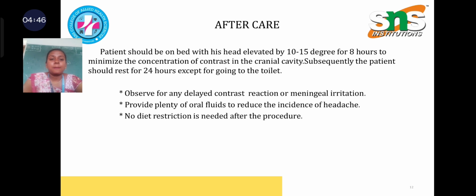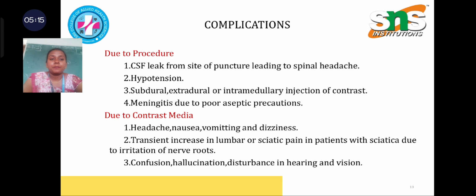Aftercare: patient should be on bed with his head elevated 10 to 15 degrees for 8 hours to minimize the concentration of contrast in the cranial cavity. Subsequently, the patient should rest for 24 hours except for going to the toilet. Observe for any delayed contrast reaction or meningeal irritation. Provide plenty of oral fluids to reduce the incidence of headache. No diet restriction is needed after the procedure.